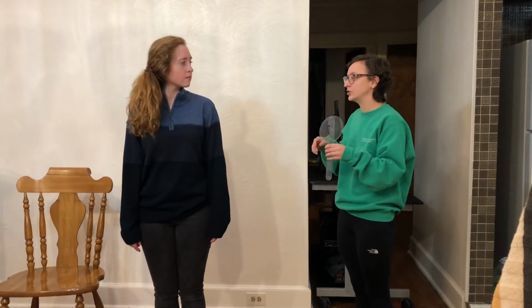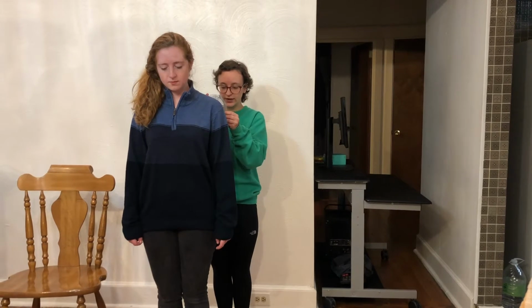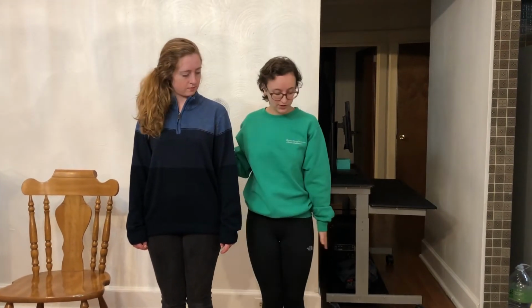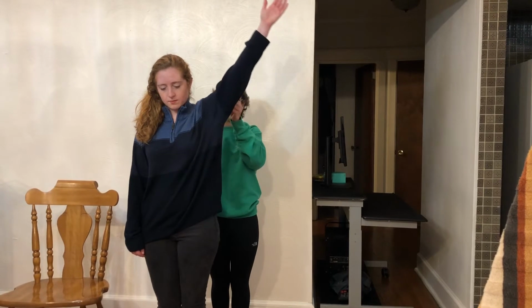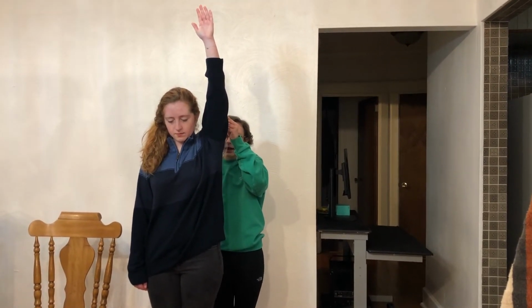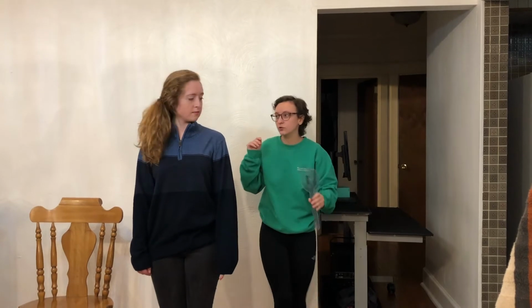Okay, now we're going to do shoulder abduction. So I'm going to put my fulcrum on the back of her shoulder here, and I've got the stationary arm lined up with the body. And what I want you to do is bring your arm out to the side, reach up toward the sky as high as you can whenever you're ready. Fantastic, okay. And up there, we're reaching 168. Great job.